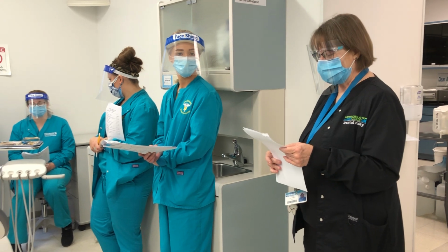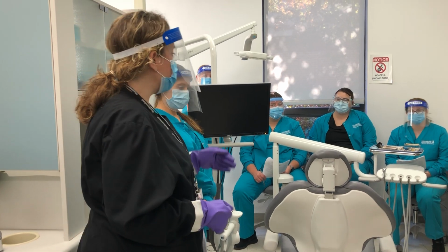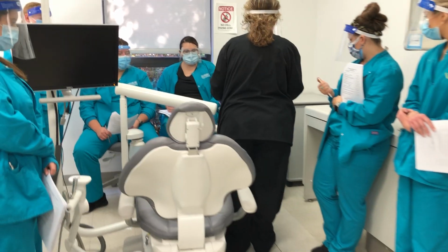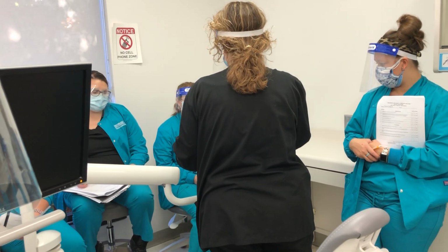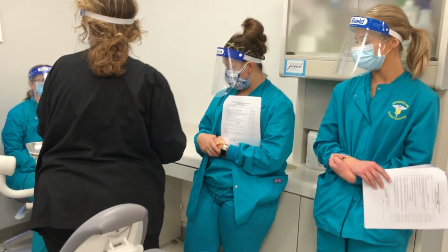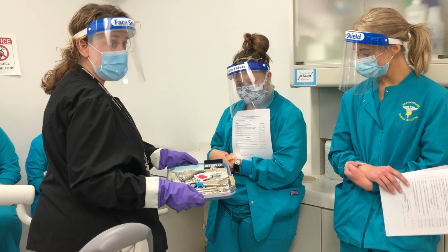Okay, so the second one says, bring tray to the contaminated area of the sterilization room. What I want to first show everybody is that if I picked this tray up and walked like this, what could happen? Say Rachel came around the corner and I bumped right into her. Stuff would fly everywhere, because look at how trays can sometimes end up.